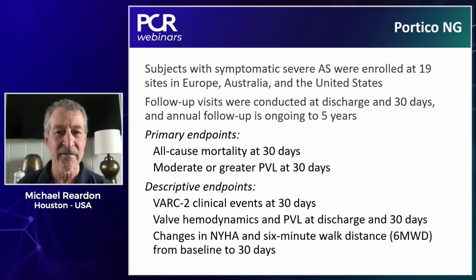The subjects had symptomatic severe AS. They were enrolled in 19 different sites across the geography we mentioned. They had follow-up visits at discharge, 30 days, and annually going on for 5 years. Our primary endpoint was all-cause mortality at 30 days and moderate or greater PVL at 30 days. We also had some descriptive endpoints of VARC2 clinical events at 30 days, valve hemodynamics and PVL at discharge in 30 days, and changes in NYHA and 6-minute walk tests from baseline to 30 days.